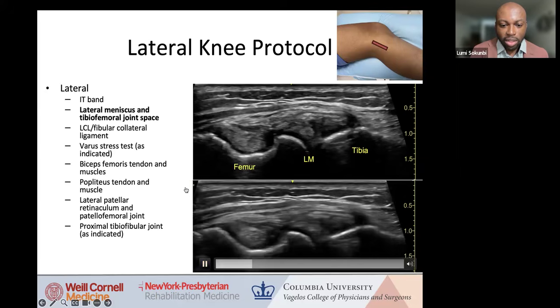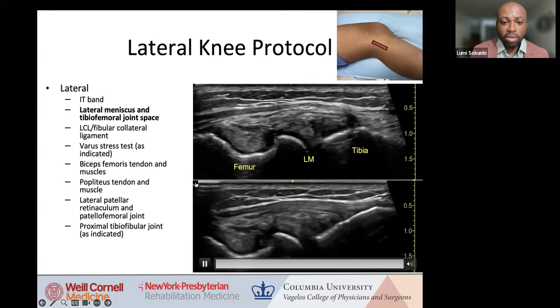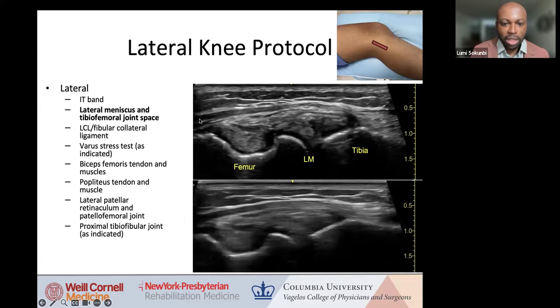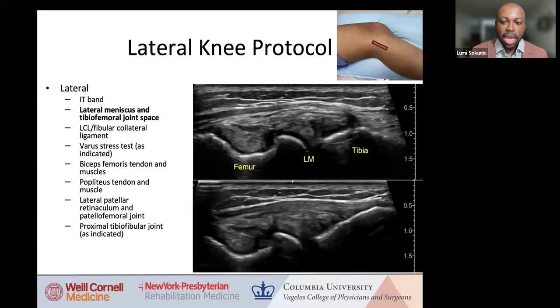In this patient, you can notice that there is this linear dark line or hypoechogenic region, which really doesn't fill in upon dynamic scanning. So based on that, it was looking like there was a tear in this region. So you're looking for tears, you're looking for any sort of parameniscal cyst or hypoechoic clefts as well. Meniscal cysts are when the lesions are filled with mucoid fluid, which is usually secondary to some degenerative meniscal tears.